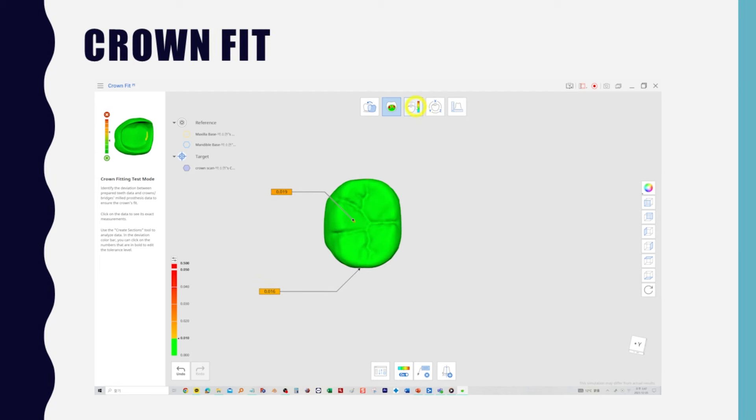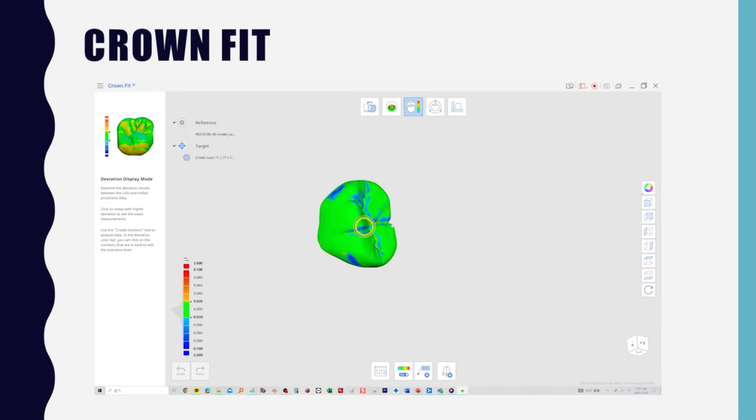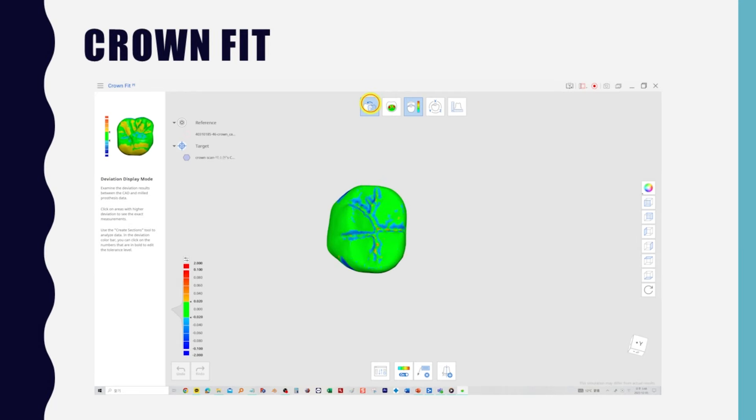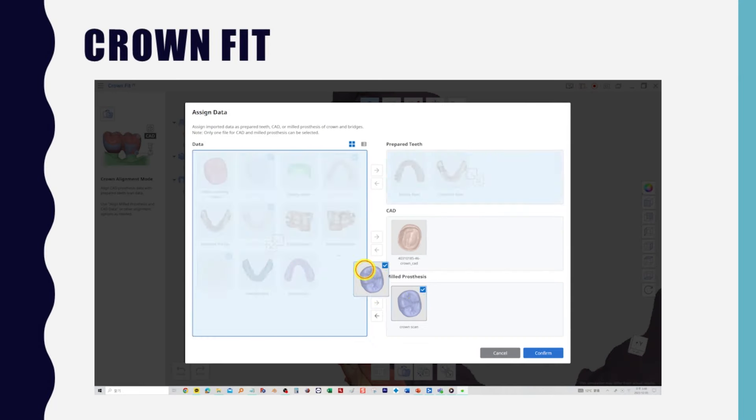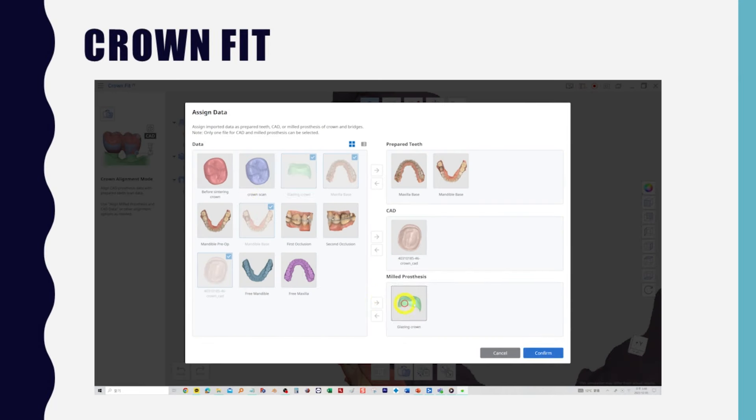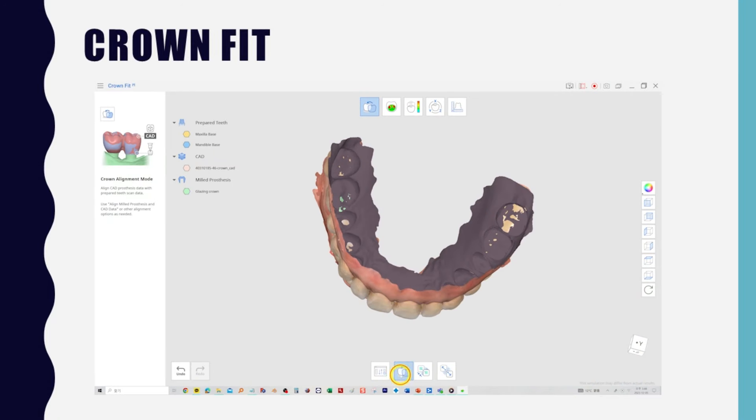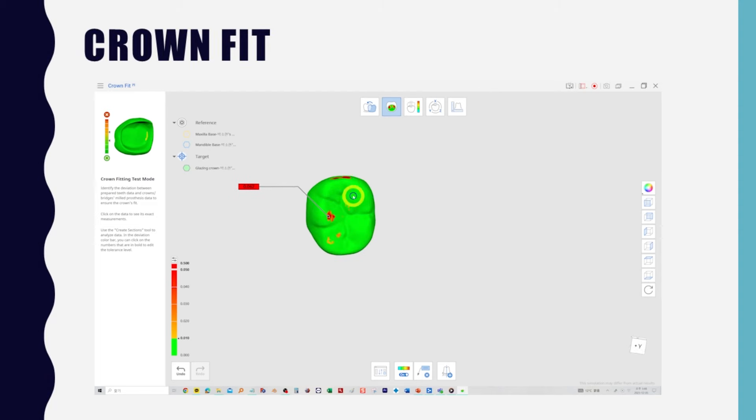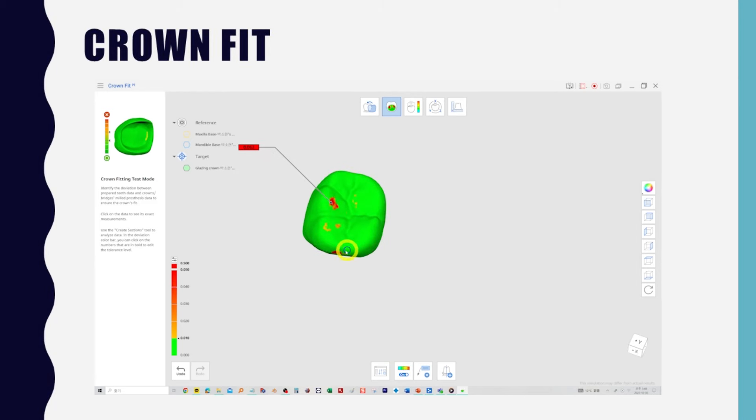This is more accurate than fitting a physical plaster model. Of course, there's also deviation display mode available in the Medit design app, which is helpful if utilized properly. Here's a glazed crown for comparison. It looks like we'll have to do a lot of occlusal adjustments. So, in the Crown Fit app, you can virtually try on the fabricated crown in the patient's mouth and estimate where interferences will occur.